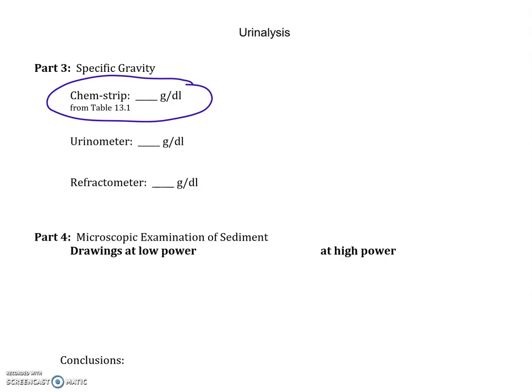Now, if you don't have that much water to spare and your kidneys have to put a lot of your metabolites and waste products into the urine sample, then of course you will have a much higher gravity because there's more dissolved stuff in the urine, and your specific gravity will be higher than 1.000. On the high end would be 1.025. That's pretty high.